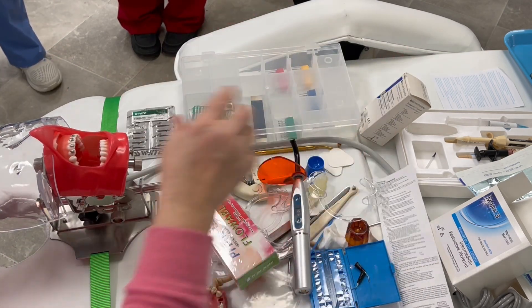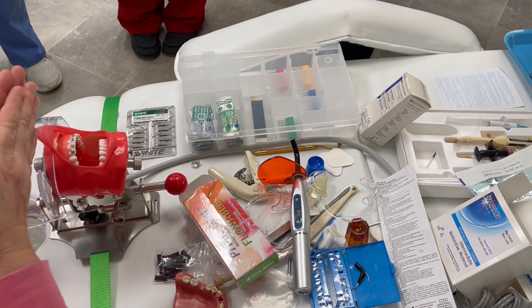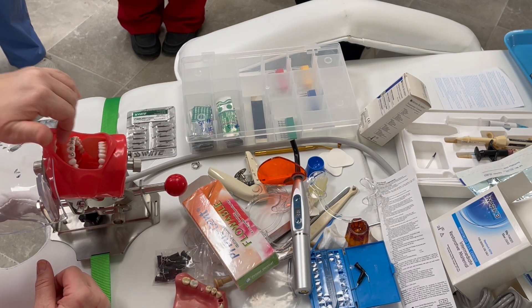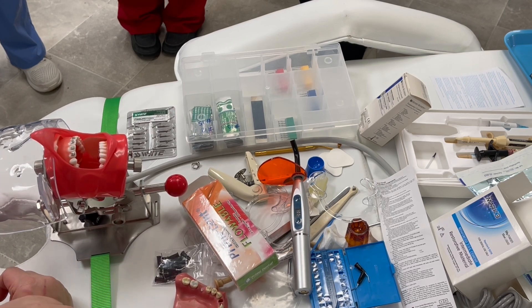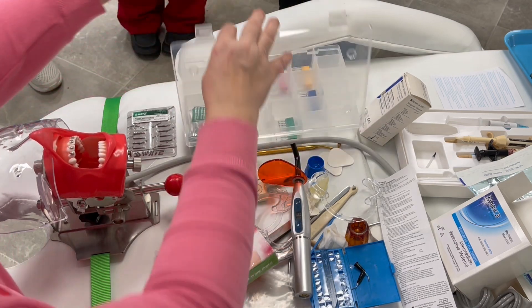We're done with the filling. We're looking, we tell the patient to close and bite. What are we gonna do to check and see if we made that composite too high? Look at those little strip things — it's called articulating paper. That's not a bite wing — that's an x-ray.